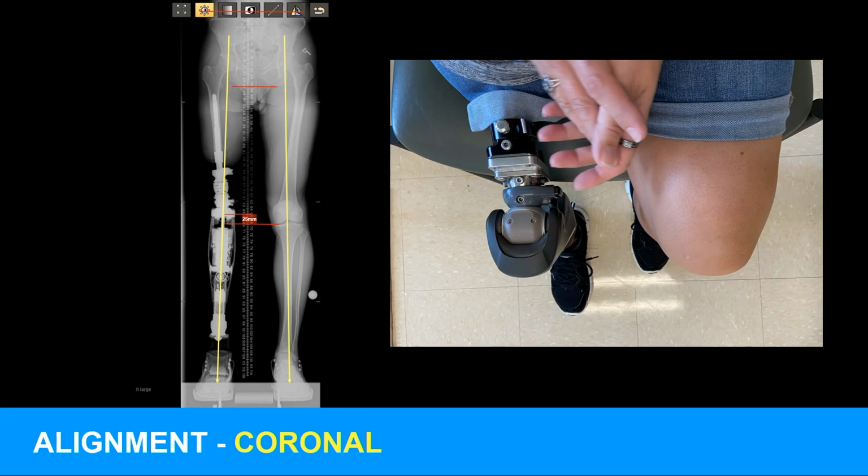Here we take x-rays at least twice in the 3 weeks they're at the University of Colorado. We make sure the pelvis is level by looking at the iliac crests or the ischial tuberosities. We start off with the knee center of the prosthesis 25 millimeters above the joint space, but more importantly is when the patient's sitting, the thigh lengths are congruent. And what's also very nice to see is that you actually see congruency in the mechanical axis of the hip, knee, and ankle.